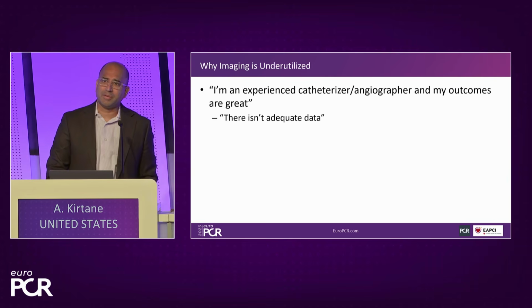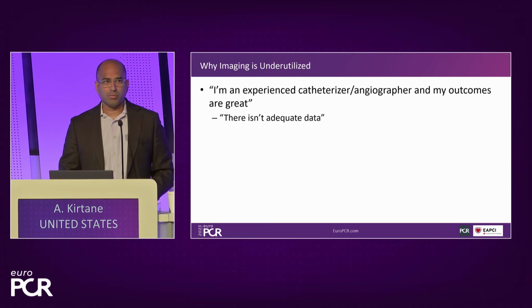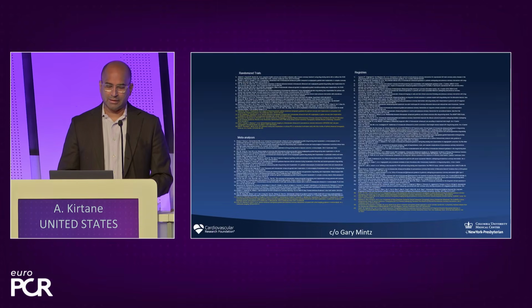I just want to start off by talking about imaging being underutilized, because I think we're hearing more and more about imaging at these conferences, but yet there are many people who say, I don't really need to do it. I'm an experienced catheterizer and angiographer. My outcomes are great. My patients do well. And I don't need to do it. And there's not adequate data to make me change. And I think more and more we're seeing now that that's not true.